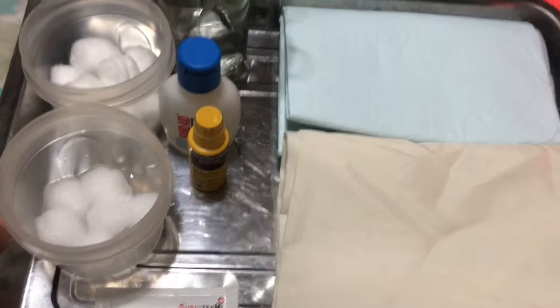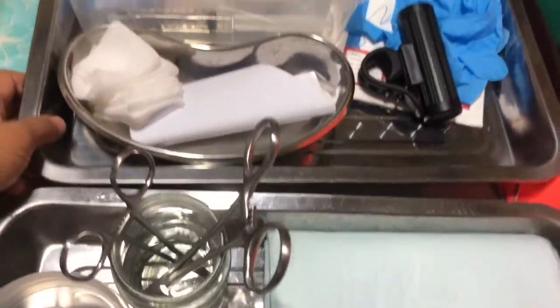First step is to check the doctor's order. And second is to assess whether the client is allergic to iodine or plaster. Next is to assemble the equipment needed. Identify and explain the procedure to the client.